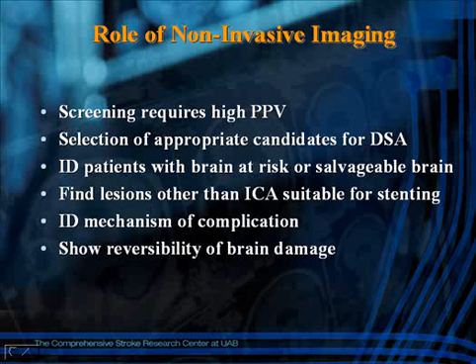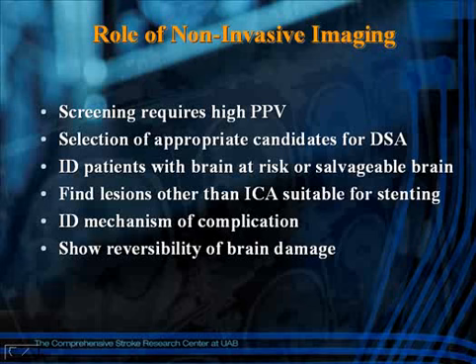Carotid duplex is particularly good as a complementary test to MRI-MRA, and there is evidence that if both show the same degree of pathology, then usually catheter angiography doesn't bring extra information. Based on two non-invasive tests, MRI-MRA and carotid duplex, you can select candidates for either catheter procedures or carotid endarterectomy.